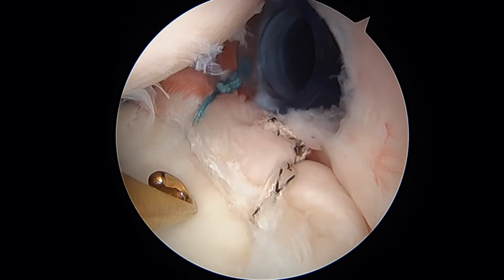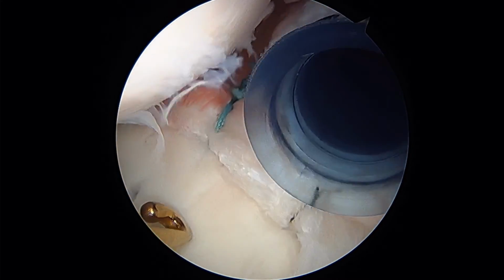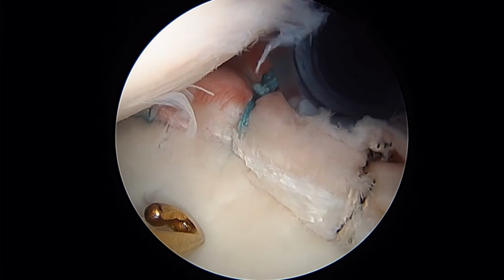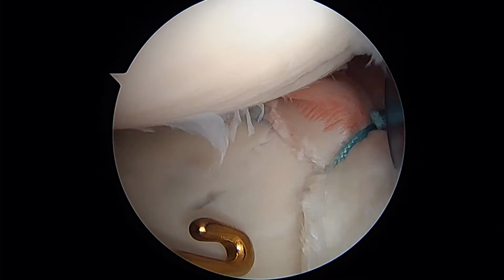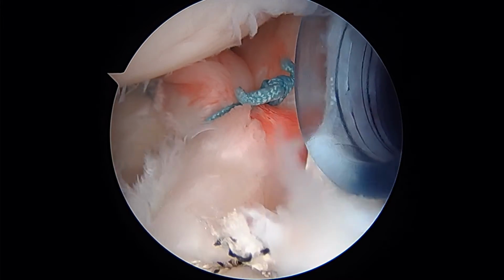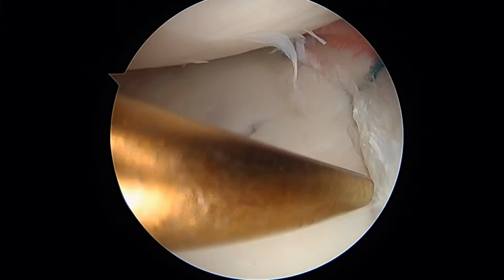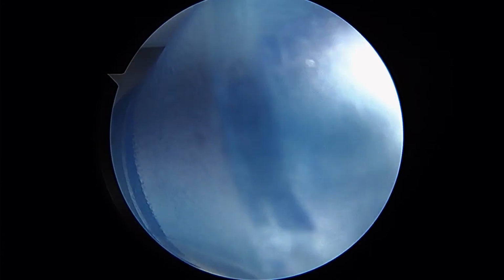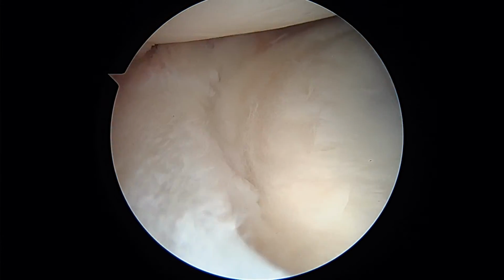Okay, so here's that third and final posterior anchor and suture. It's the black and white one. We didn't get as much capsule with that, but now as we look down the back of your shoulder, we can see that things are a lot tighter. I'm hoping that provides some posterior stability. And now we're going to look down the front. I'm going to push this cannula in a little bit.